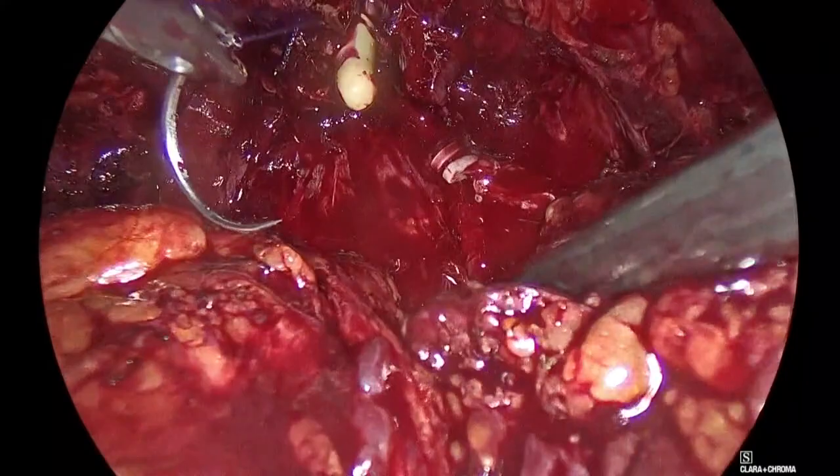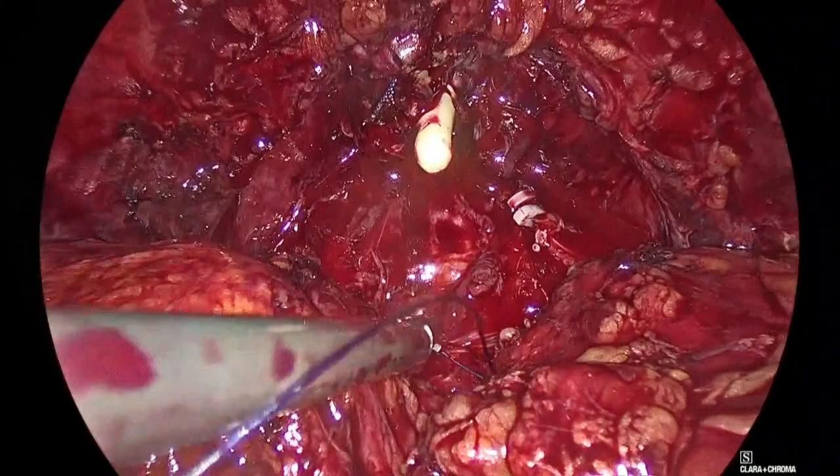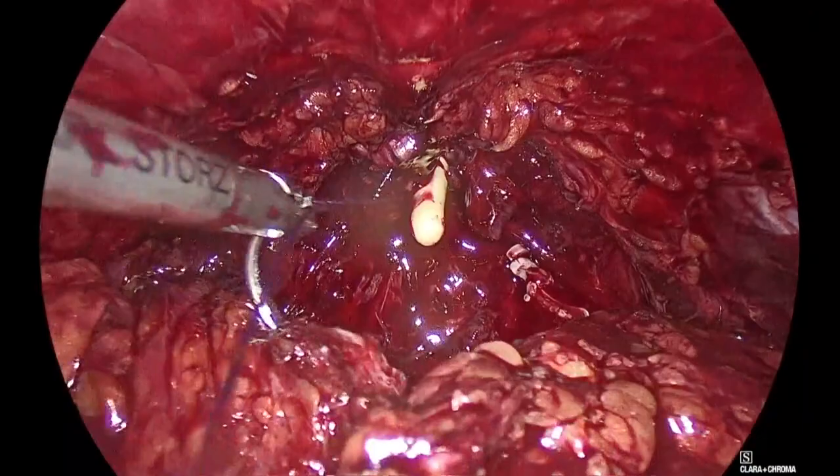Now, the first trick here is to find the bladder. Rotate. There. Go back. We go fishing, eh? And what about the ureteric orifices?